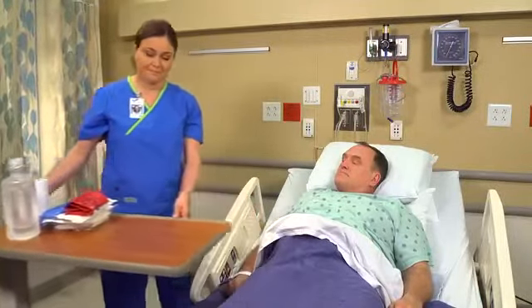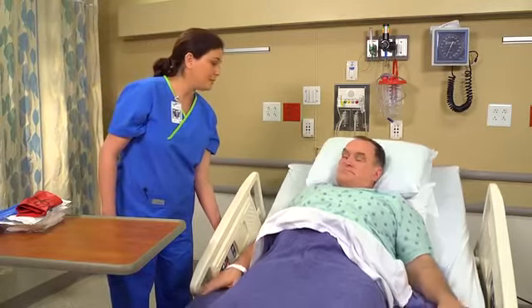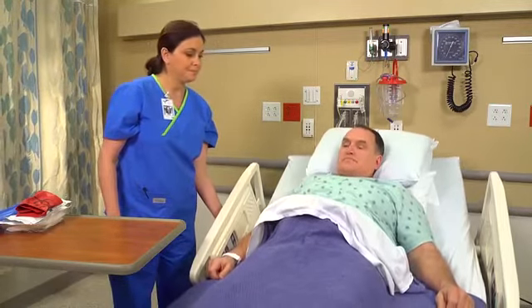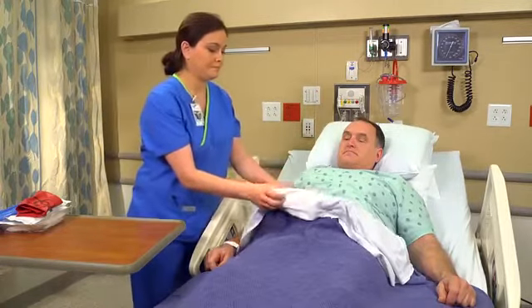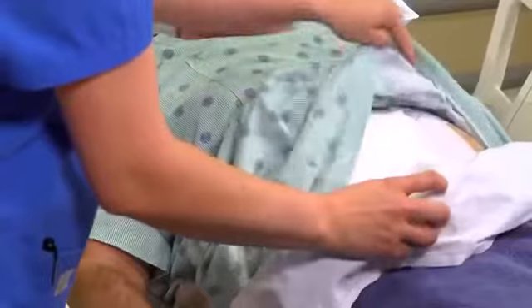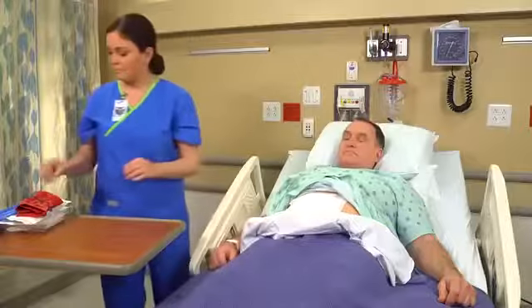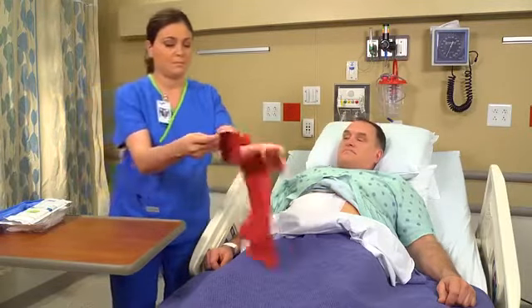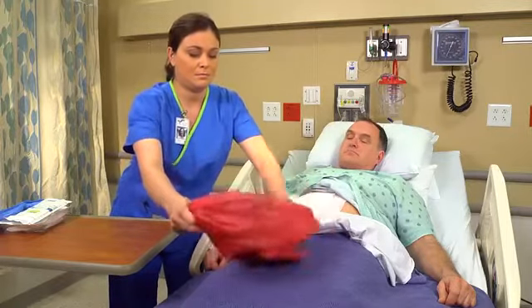Put on a gown and goggles if there's a risk of spray. Position the patient comfortably and drape him so that only the wound site is exposed. Instruct him not to touch the wound or the sterile supplies. Place a disposable biohazard bag within reach of your work area and fold down the top of the bag to form a cuff.